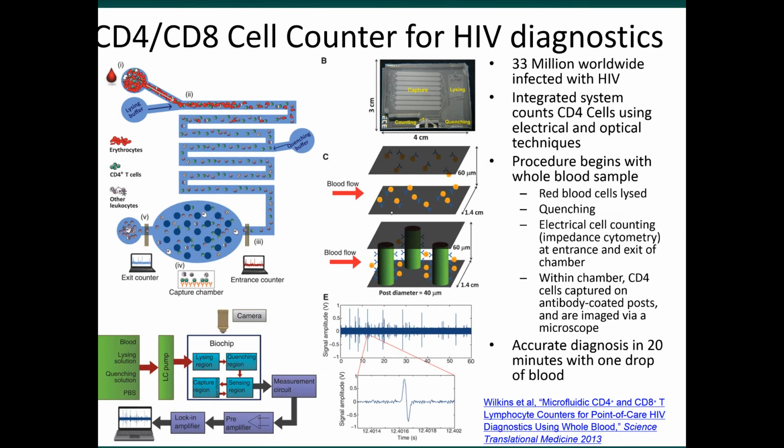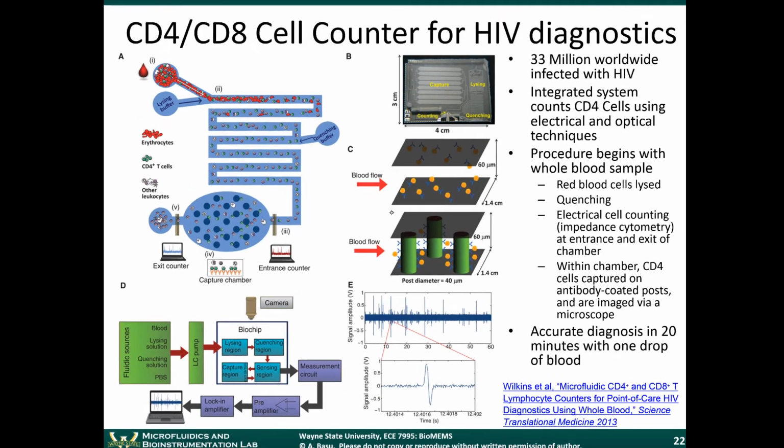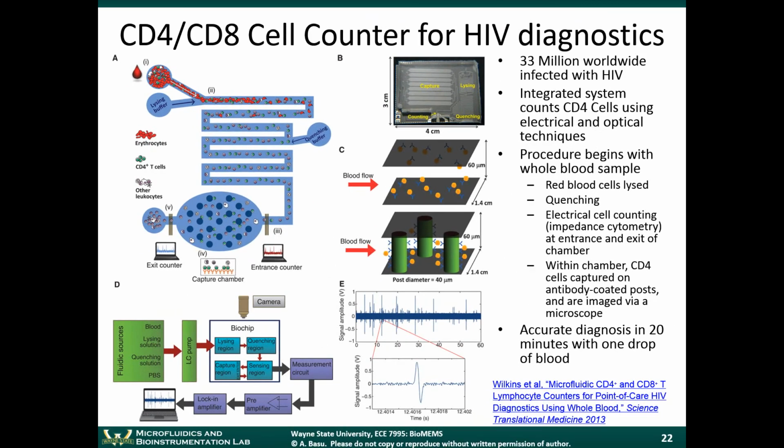Okay, so this device does the accurate CD4 counts in about 20 minutes with a single drop of blood. So notice that microfluidic device is using very small amount of blood. So that's also nice for the patient because you can get by with just small pricks instead of the big needle that they use when you're donating blood or when you're having like 100 different tests done at your doctor's office.